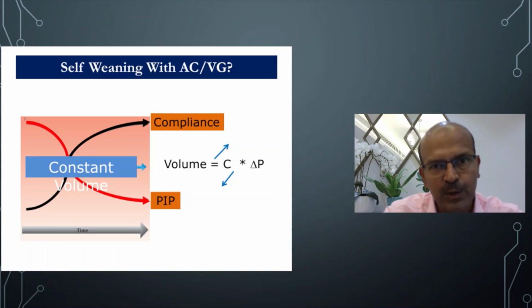And then if it's going too high, you need to check whether the baby really needs to reach that PIP, because it's ultimately the pressure that reaches the lung that damages. So even if it's a volume guarantee mode, if the baby keeps getting 25 PIP, well, actually you could manage on 21, 22 PIP on SIMV, I would prefer the SIMV mode. So both extremes are not good. So you have to balance it, and you can always keep on one mode for a few hours and change back. It's no hard and fast rule that you should stay with a single mode.